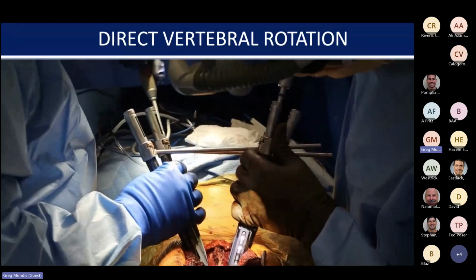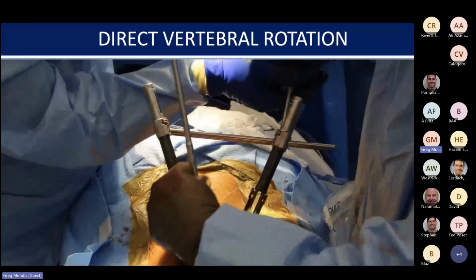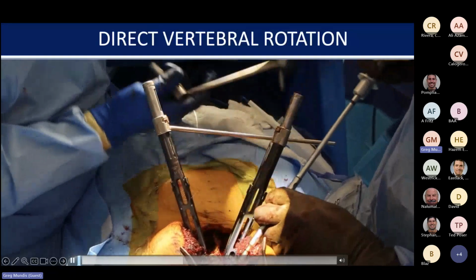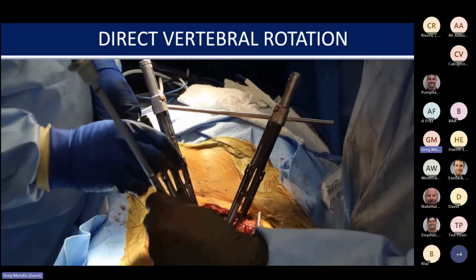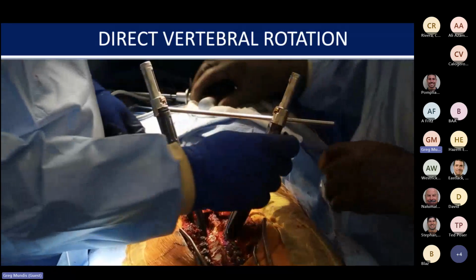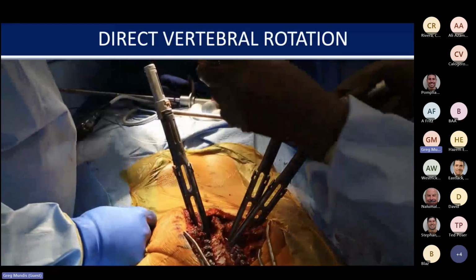And so what we'll do here is you're rotating this. You're not necessarily going in a flat plane. You're actually trying to lift the spine out. But you can see how these are now really well aligned in the coronal plane. When I do this, I usually over-rotate it by maybe 5 or 10 degrees because I know that there's a little bit of flexibility in the system. So in theory, we've now made the next level the same as the neutral vertebrae.